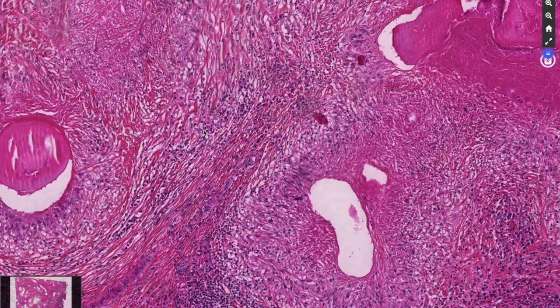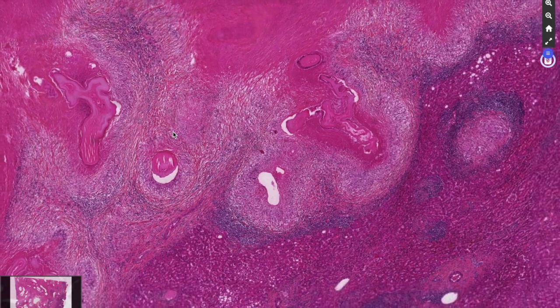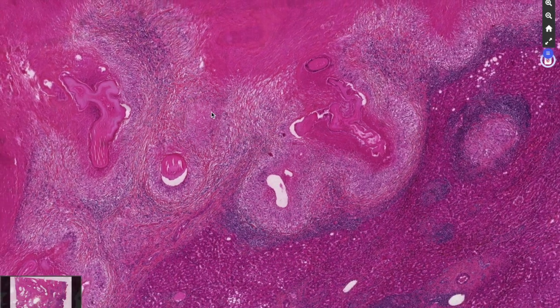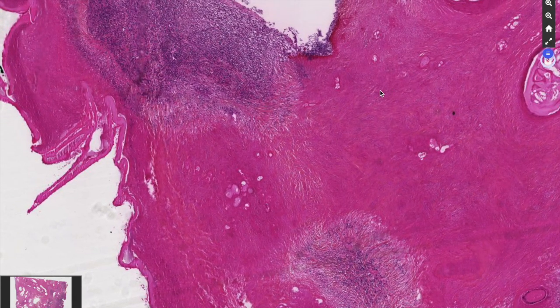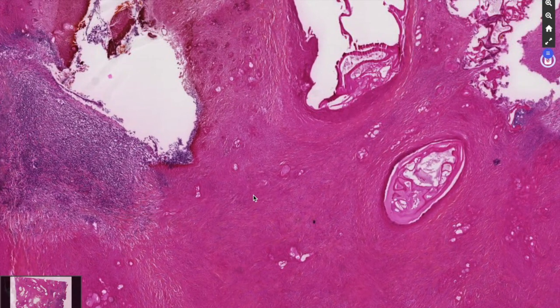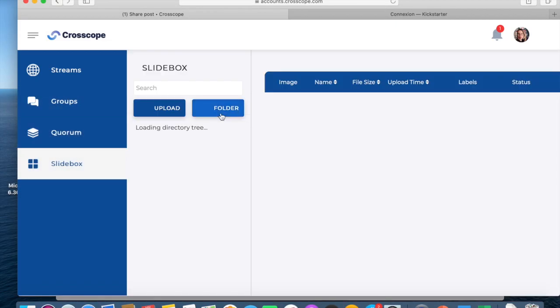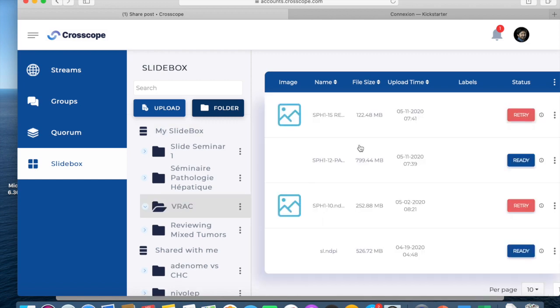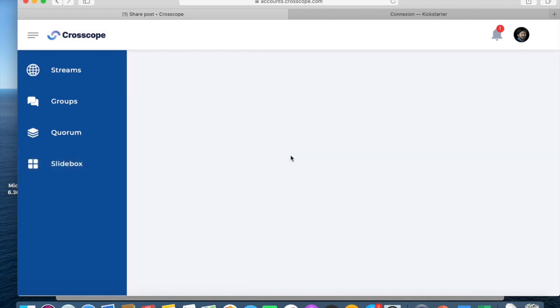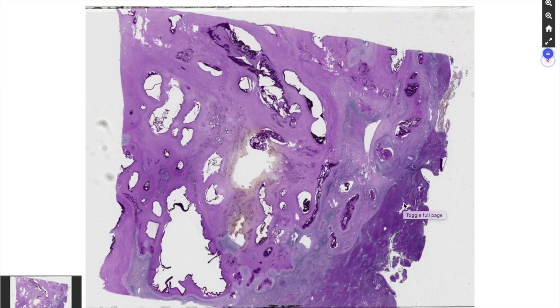And what you can do to further confirm your diagnosis is a particular staining, periodic acid-Schiff staining. So we'll check this special staining together. It was not included in the seminar. It was on purpose. The important thing is to think to order the staining, and it's really a nice staining.